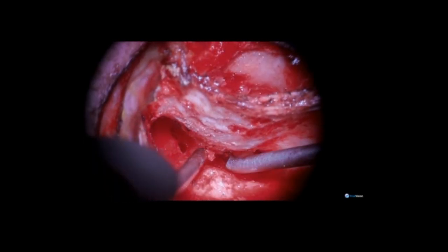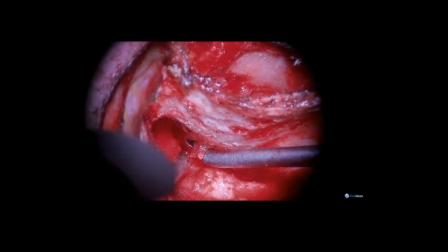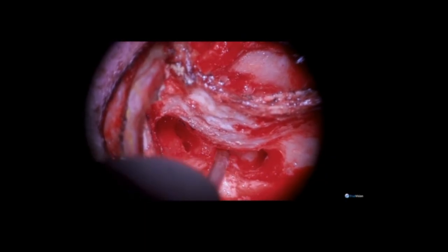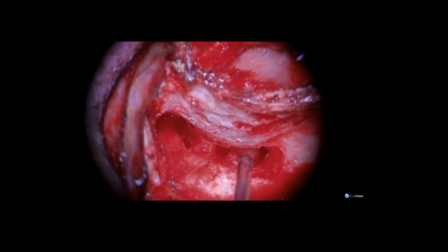Using a curette, I will explore around the medial canal wall edge to make sure that any remaining keratin fragments are removed.